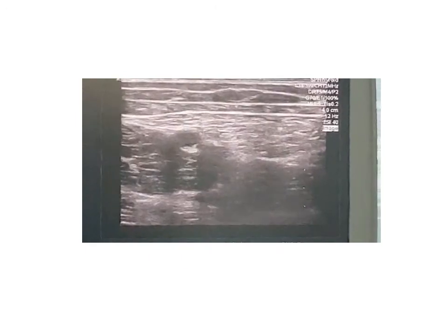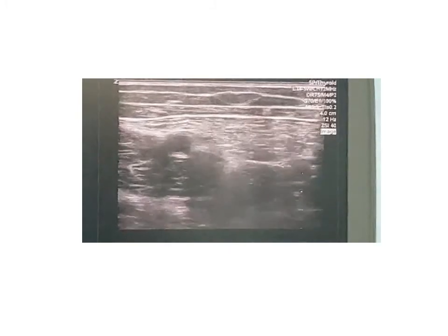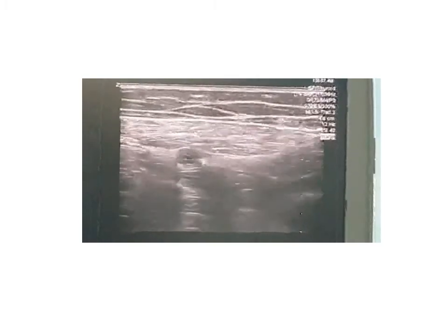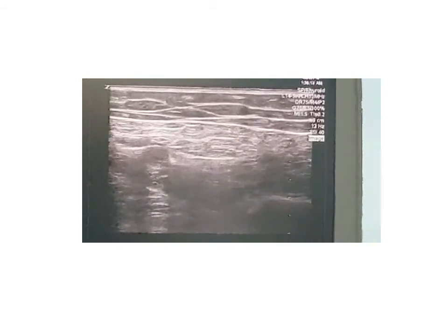This is the anatomy proximal in the adductor canal, where what we block may in fact be in the femoral triangle. As we go distally, the artery moves more laterally with the probe. Here is lateral, and the other side is medial. So now in this position it is more lateral. The block here is equivalent to the first one, but with less motor paralysis.